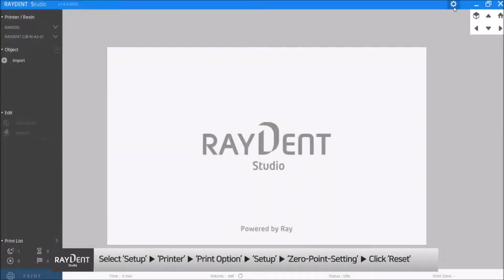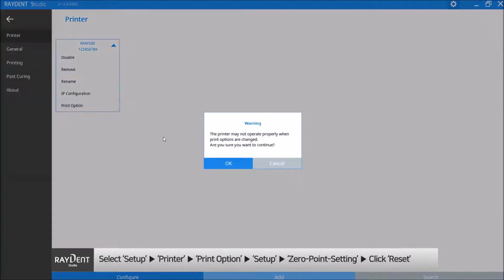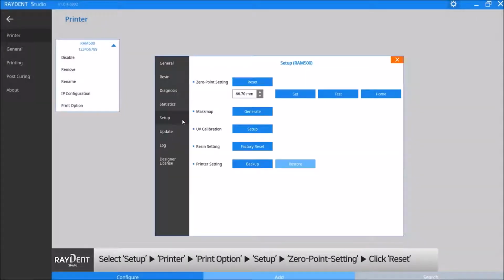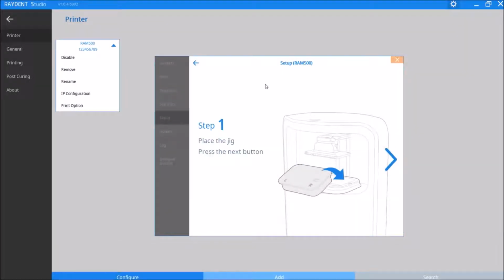In Studio, go to Setup, choose the printer, click on the arrow and click on the Print option. Click OK when the setting change warning pops up, then go to Setup and click on Reset. Then the software will guide you through the Z-point calibration in 3 steps.